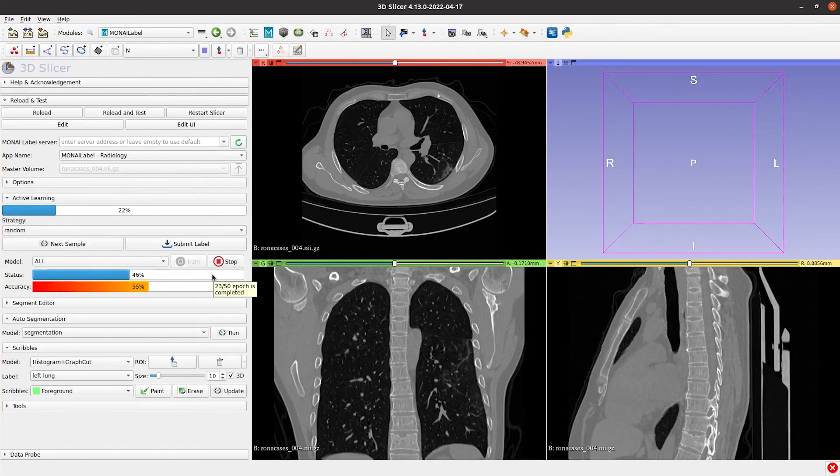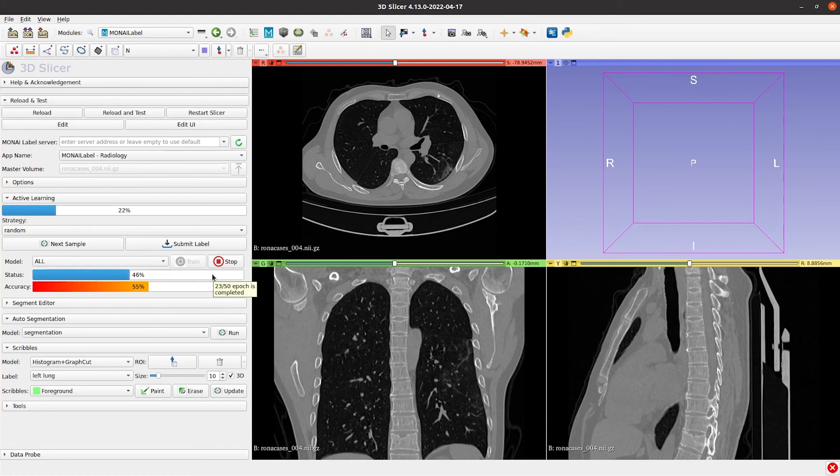From previous experiences, to get a model with decent lung segmentation results, you will need to first segment 10 to 15 volumes, and then train the model for around 800 epochs.